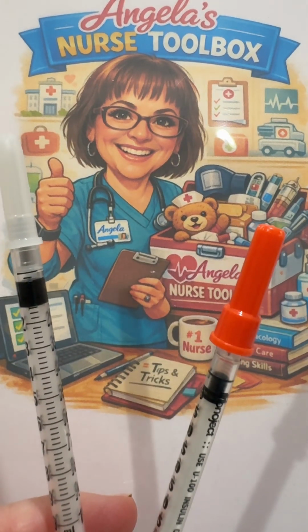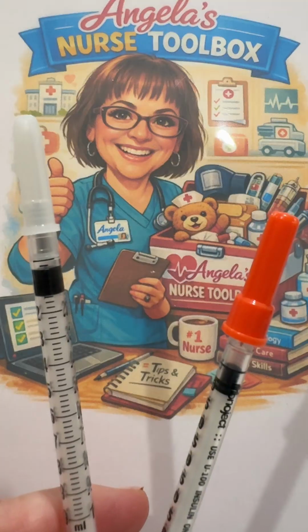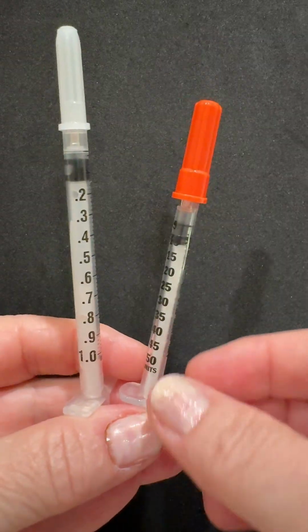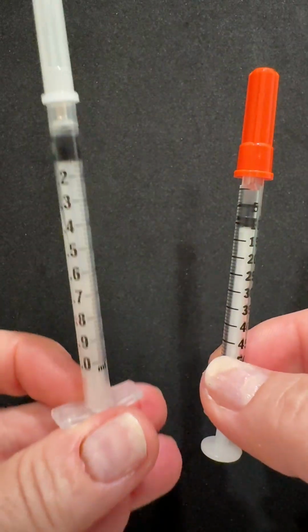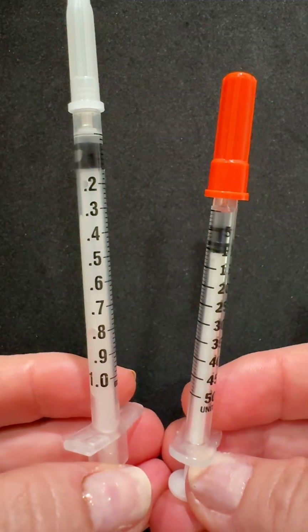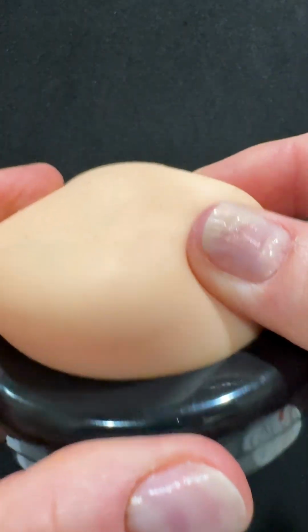Let's talk about giving subcutaneous injections, choosing the correct needle length and gauge for a subcutaneous injection. Some common medicines that we give subcutaneously would be insulin and heparin, and some vaccines that we give subcutaneous. So subcutaneous means into the fat. With our patients, when we are giving an injection, you're going to be giving it into the fatty part of the tissue. So sites are commonly the abdomen, the back of the arm, or the thigh.